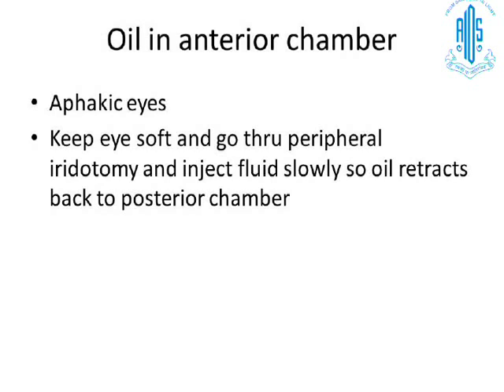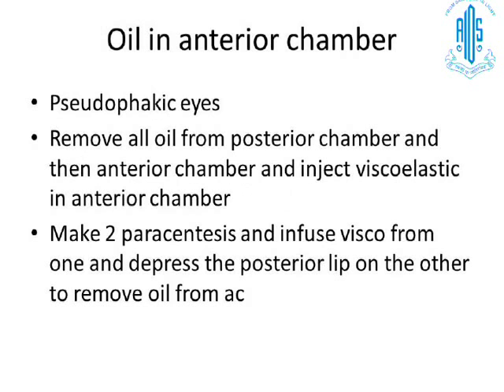However, when you are doing this maneuver, you have to remember that the eye has to be soft. If the eye is hard at this stage, instead of the oil going down, your fluid itself will go down and the oil will still remain up. Again, if this happens in pseudophakic eyes, then you will really have a problem, because if the oil is there in the anterior chamber, you don't know what to do.